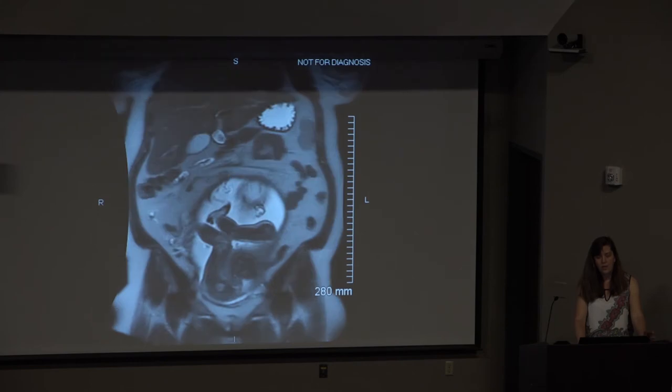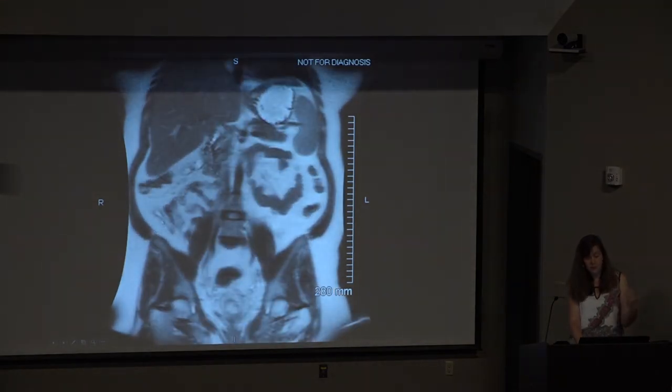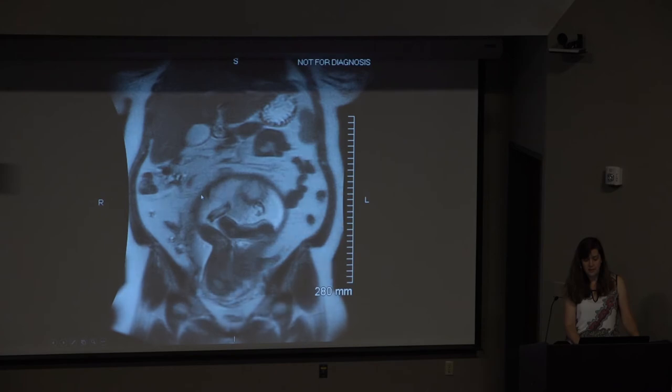So now you know you have to go in, or potentially have to go in, to treat this patient. So this is obvious, right? Because otherwise, the appendix, if it was normal, would look like the rest of the bowel, kind of wiggly and decompressed. So that's how we figure out if it's appendicitis or not.